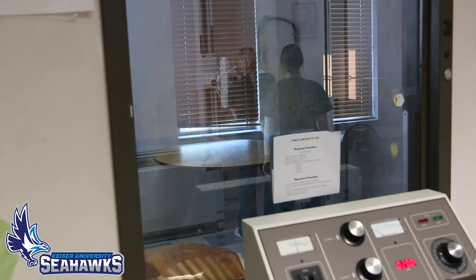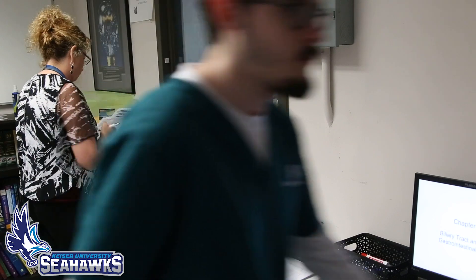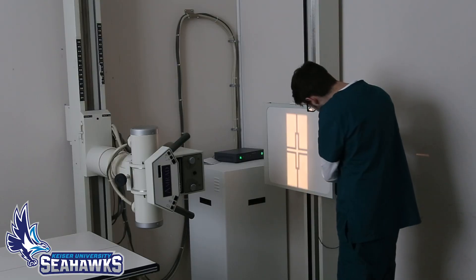We're learning positioning back in the lab, learning how to position for the esophagus. We learned three different positions this week: the RAO, the lateral, and the AP abdomen supine.